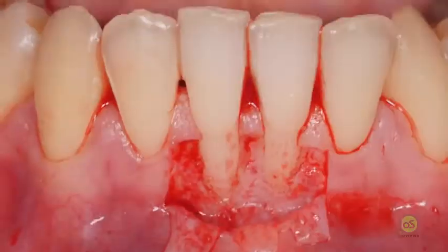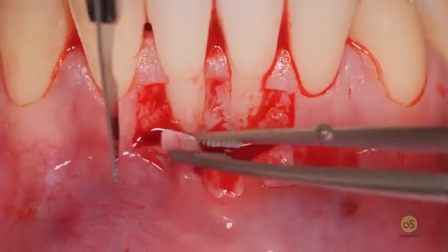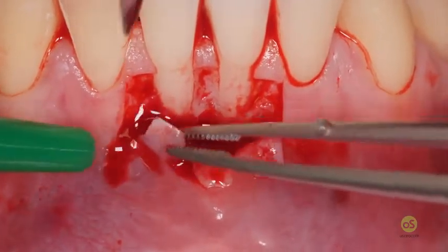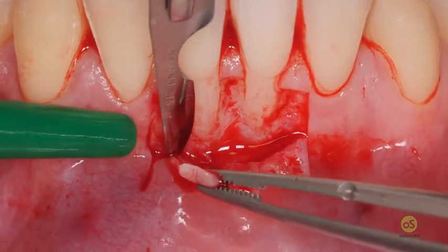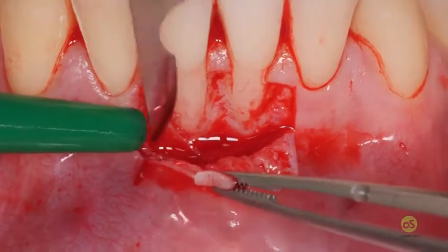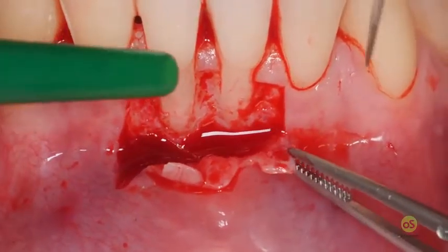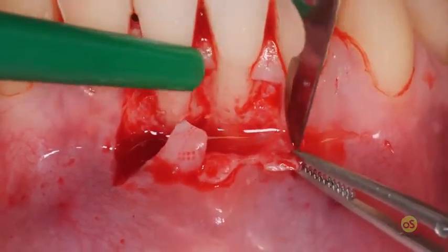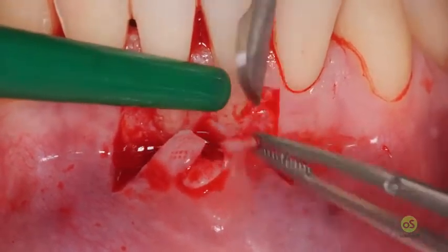So for the first time I increased the length of the vertical release incision in alveolar mucosa, making this incision very superficial. One side. Same thing on the other side. Increase the vertical release incision. Make this incision very superficial.